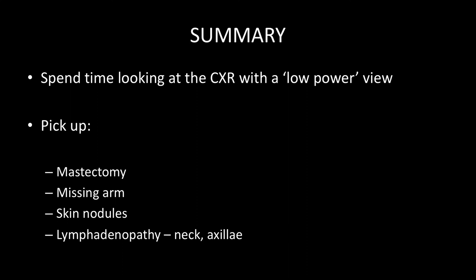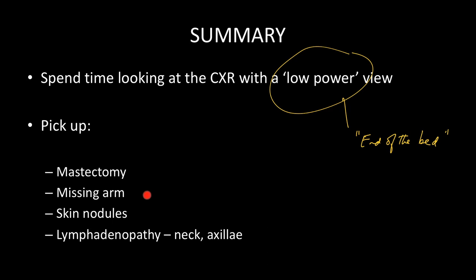In summary, it's well worth spending time looking at the chest x-ray with a low power view — or as I like to call it, looking at the chest x-ray as if you're looking at the patient from the end of the bed. In this way, you'll pick up a mastectomy, a missing arm, skin nodules, and lymphadenopathy in the neck and axilla. When you see all of these features by looking at the film from a distance, you'll then be able to hone in on the film looking for evidence of metastatic disease, neurofibromatosis in the case of skin nodules, and lymphoma confirmed by looking at the edge of the film.